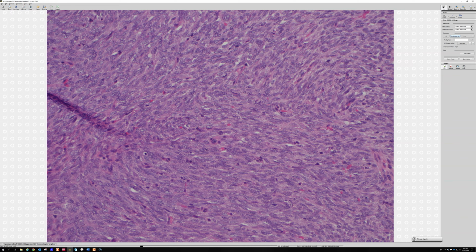They often will be kind of patchy and focal, so you can have big areas that don't have staining. When you have a biphasic synovial, they tend to really light up the epithelioid cells, making the little glands, but also you should see some scattered staining in the spindle cells. So those are great stains. TLE1 should have strong diffuse staining in the majority of synovial sarcomas.